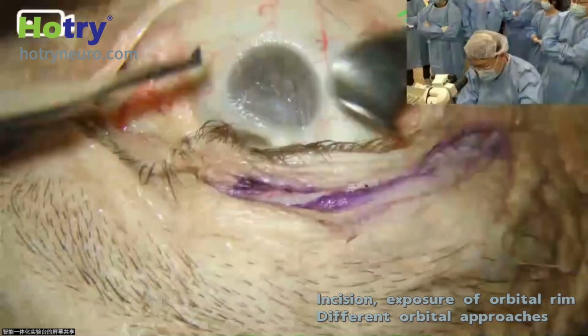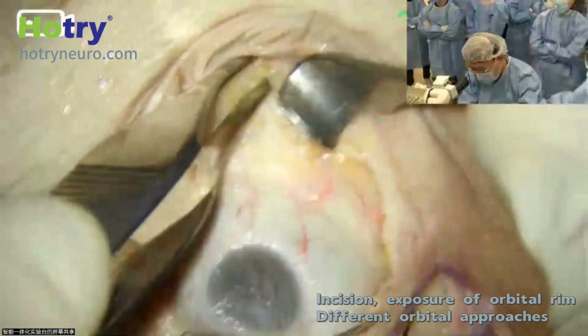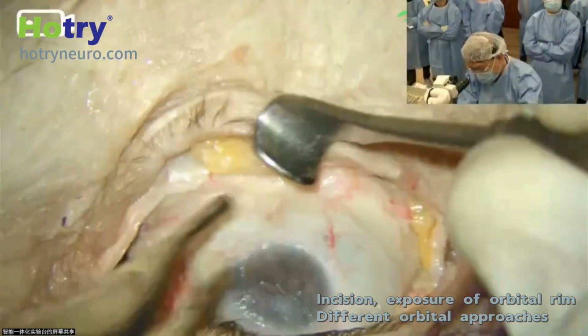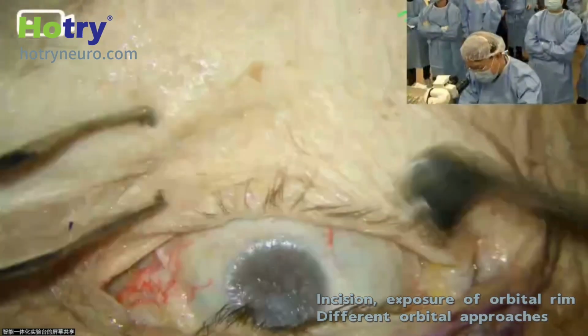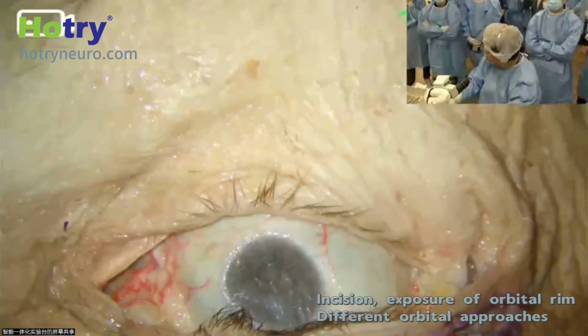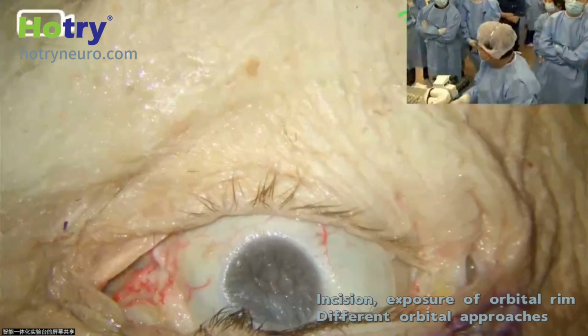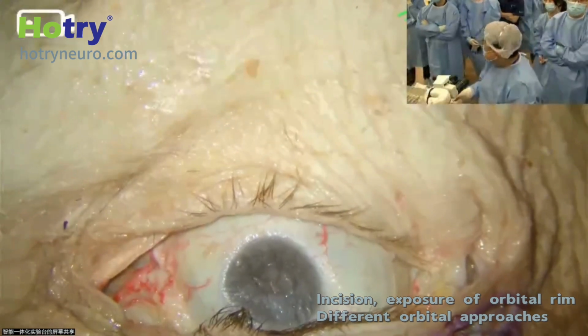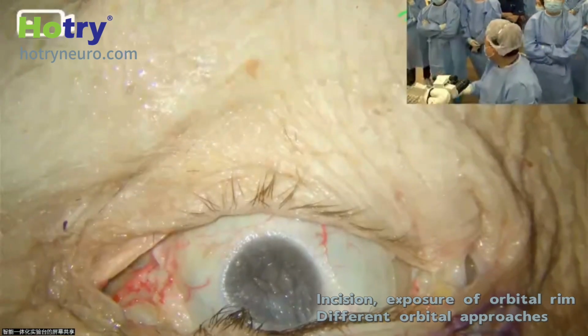For example, for the inferior transconjunctival incision, I close with maybe 6-0 sutures, and then close the lateral canthus. In fact, if you put everything in position, it will heal nicely. If you want to remove the sutures, it's fine. If you don't remove them, they will just fall off by themselves.